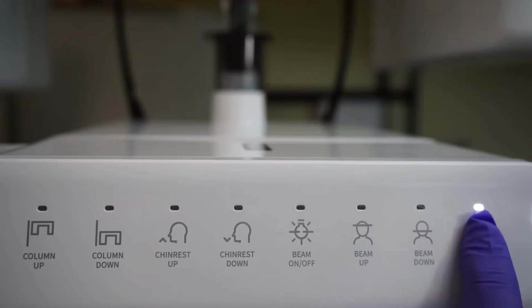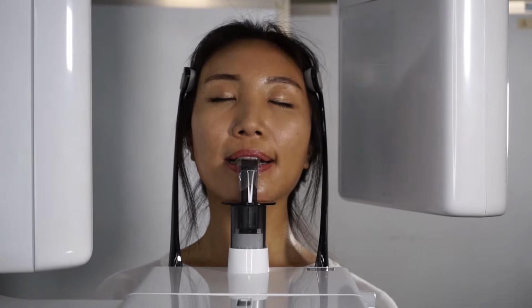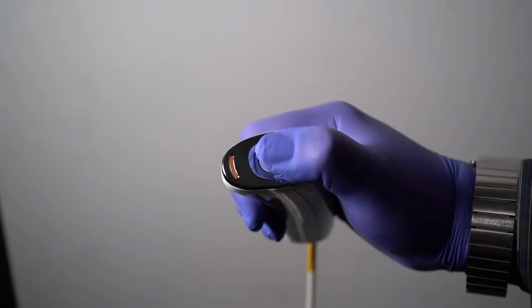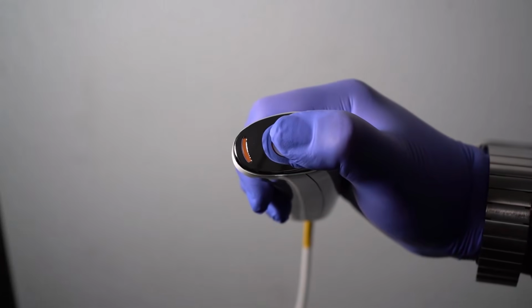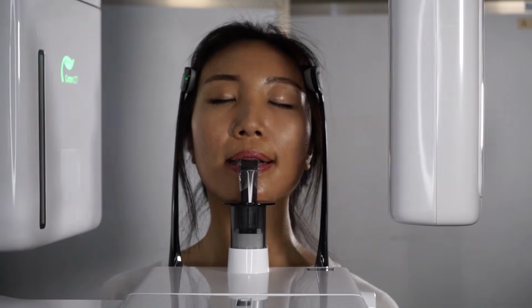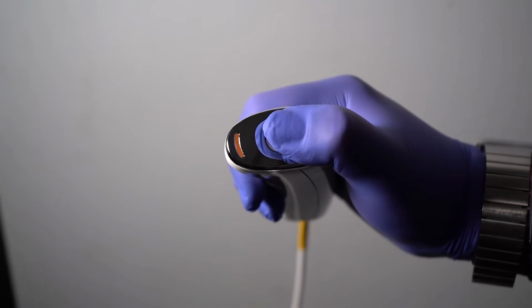Once completed, we can hit the Ready Return button on the front panel of the unit and the machine will rotate to capture position. Have patient close their lips, tongue at rest, and eyes closed. Hold the button on your acquisition trigger switch, which will turn yellow when exposing. Note, it is extremely important that the patient stay as still as possible during image acquisition, as this will affect your image quality. Hold the button until the image acquisition is fully complete.